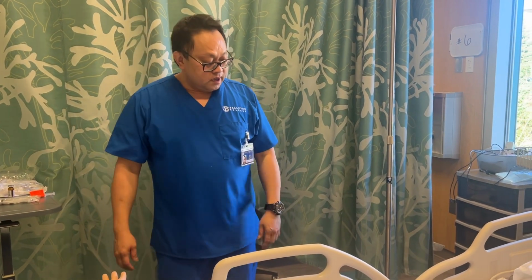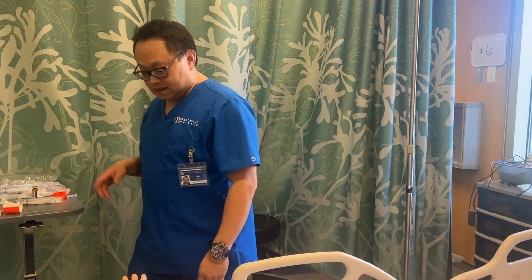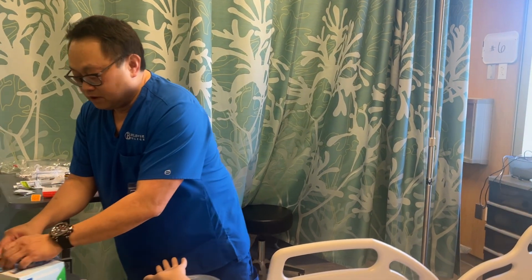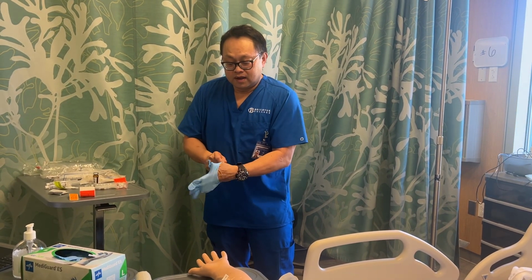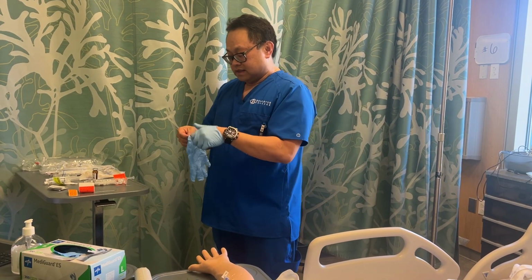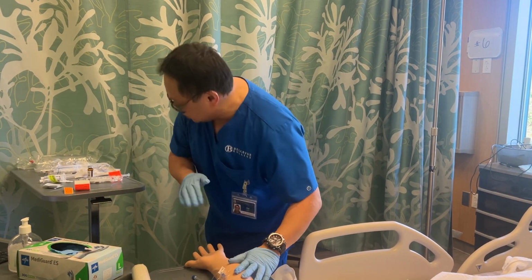So I'm going to assess the site before I give the medication for phlebitis, which is redness at the site or warmth, hot, and then I'm also going to assess the site for infiltration, which is leakage, coolness around the area. So I'm assessing the site, hand sanitized, and I'm assessing the site.